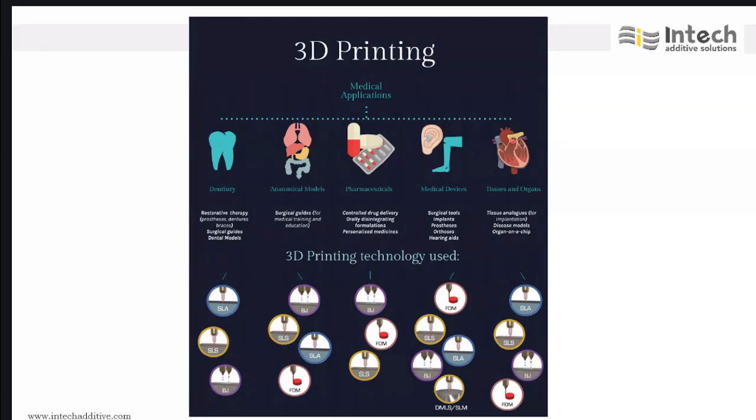And powder bed fusion, so mostly it's used for metal implants, and you can even use it for polymers, especially if you want to make nylon models. Mostly they make very strong parts. And then we have this material extrusion or FDM, fused deposition modeling. If you want to make prototypes at a lower cost, then we can go in for this particular process.